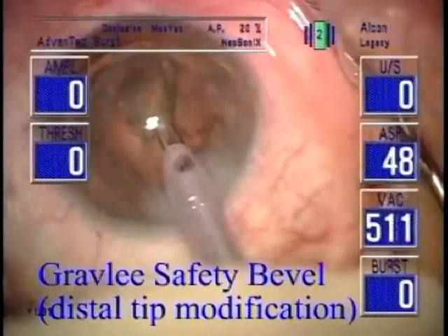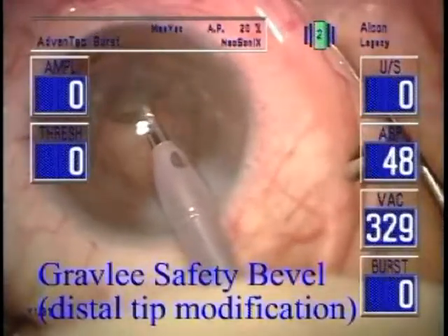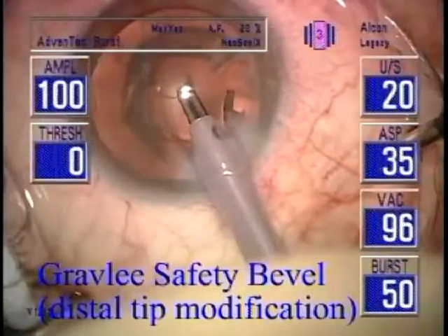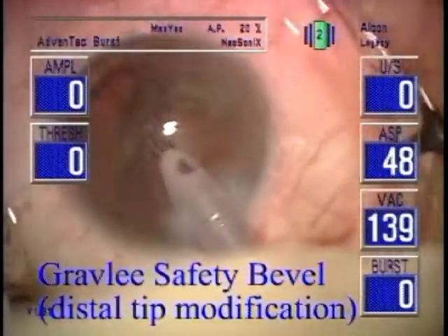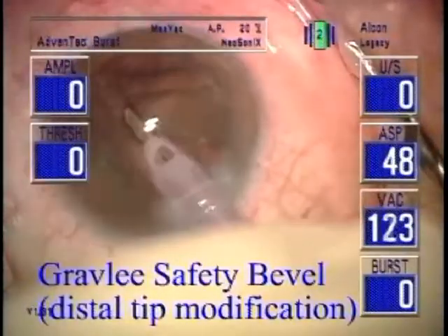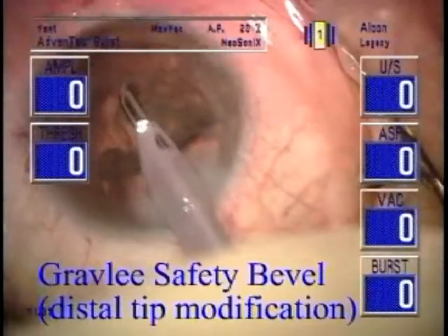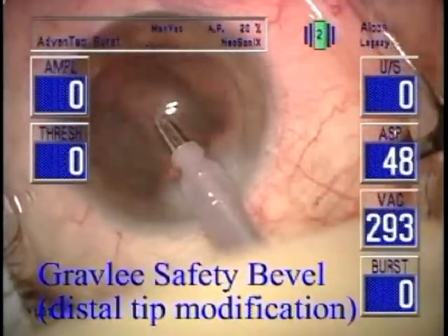The Safety Bevel Probe is safer when the posterior capsule comes forward because it is less likely to present a sharp edge compared to a traditional probe distal end tip design. Another safety aspect is that the posterior capsule has to travel a longer distance since much of the metal present on a traditional tip has been removed. Decreasing the mass of metal at the distal end tip also improves visibility, hearkening back to the first rule of surgery: obtaining adequate exposure.